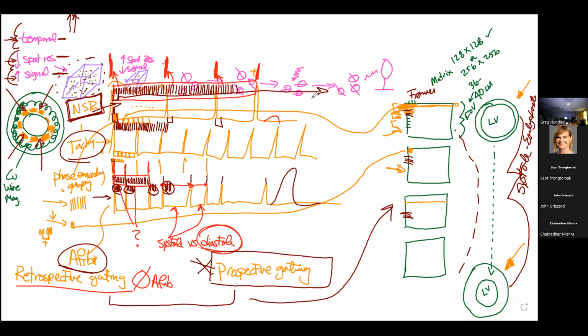Okay? So what Shelley and team are constantly doing, and you guys, when you're looking at the images, is balancing the temporal resolution, the spatial resolution, and the amount of signal to get the images. And we do a lot of that for you because folks that have been doing this for a long time have come up with some pretty good standards to collect these images so that you get pictures like that.